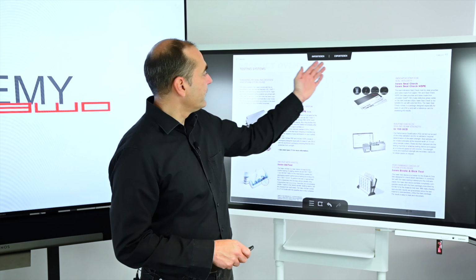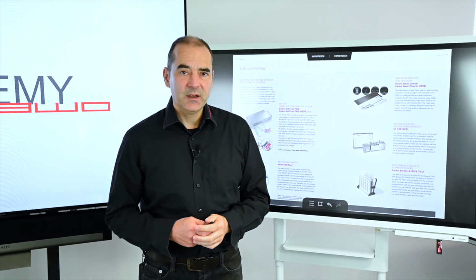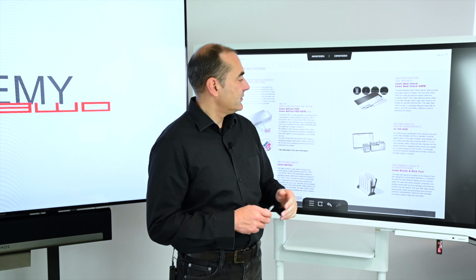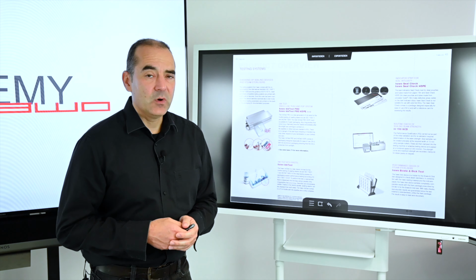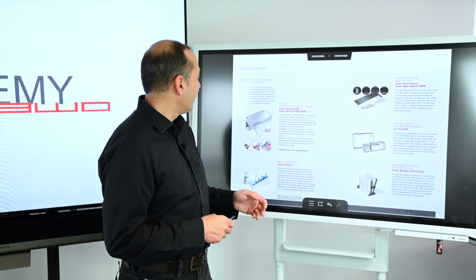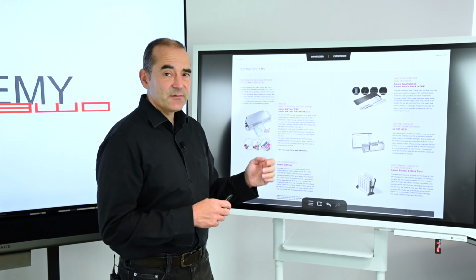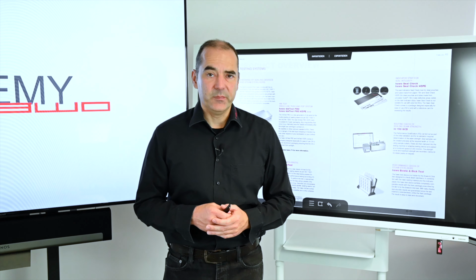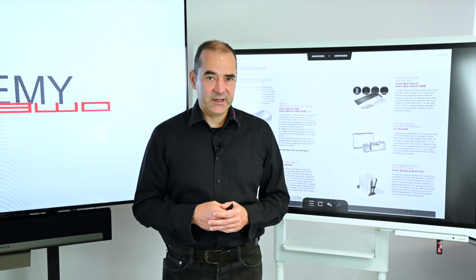In our product overview on hawo testing systems, you find our hawo test 150 SCD as well as our array of further testing systems specifically adapted to the different film materials or available sterile barrier systems.